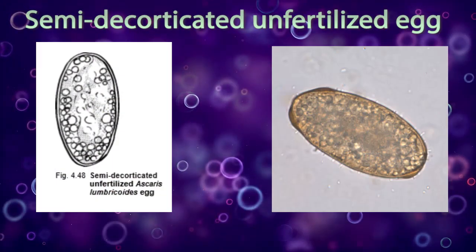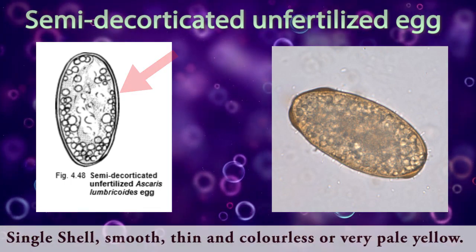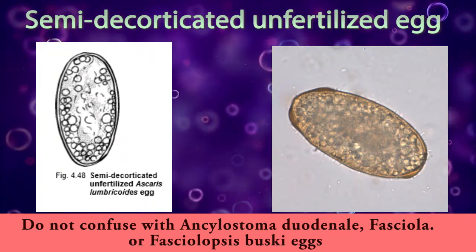Semi-decorticated unfertilized egg. Single shell, smooth, thin, and colorless. Do not confuse with Ancylostoma duodenale, Fasciola or Fasciolopsis buski eggs.